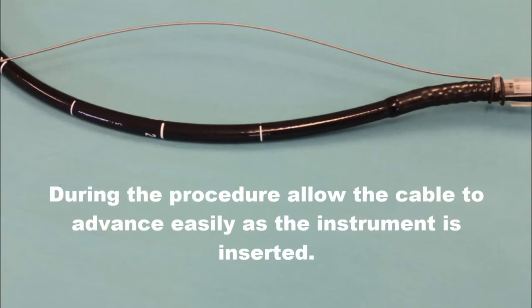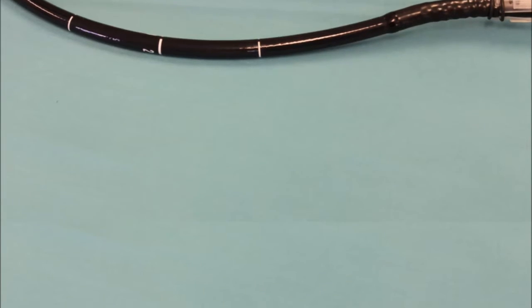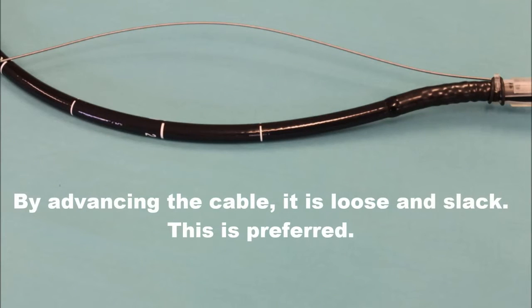During the procedure, allow the cable to advance easily as the instrument is inserted. Here, the cable is being held too tense and tight. By advancing the cable, it is loose and slack. This is preferred.